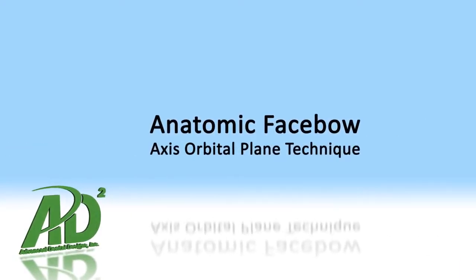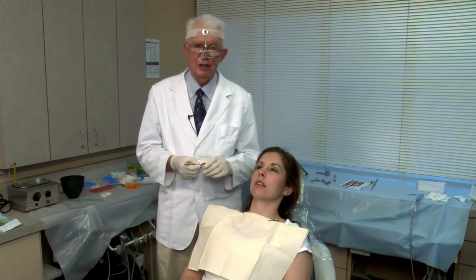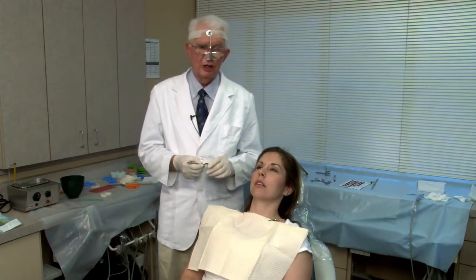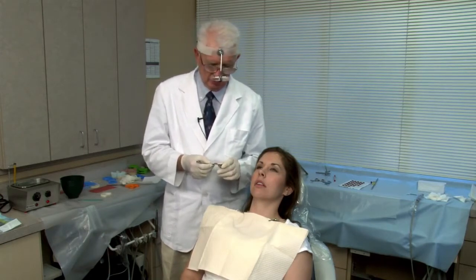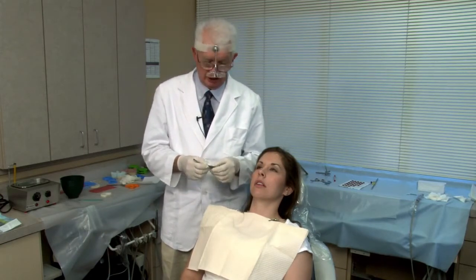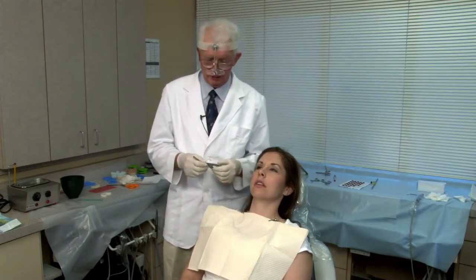We're going to do another earbow procedure, only this time we're using the axis orbital plane. So we'll be using a nasion relator to position the anterior part of the face bow vertically. I'll be marking the orbital pointer and a couple other marks, which I'll explain later.